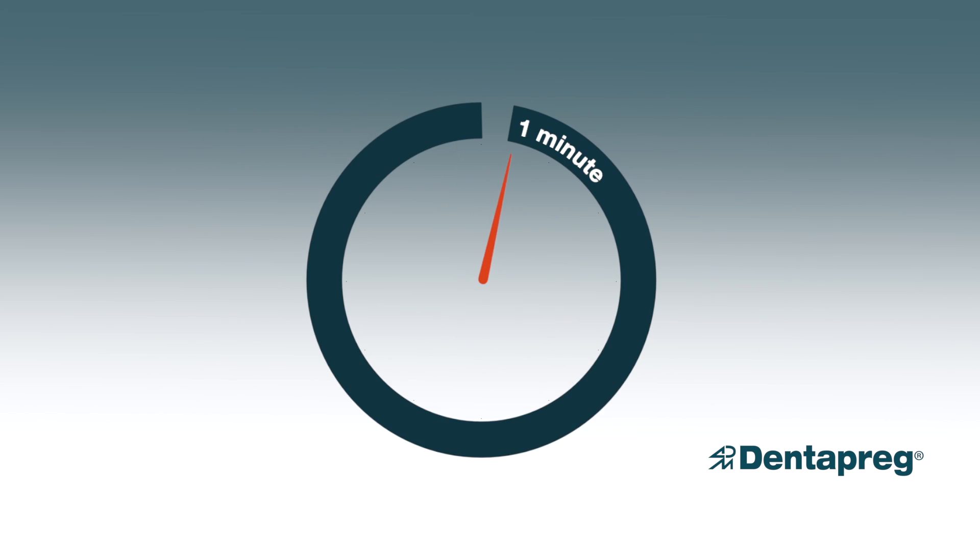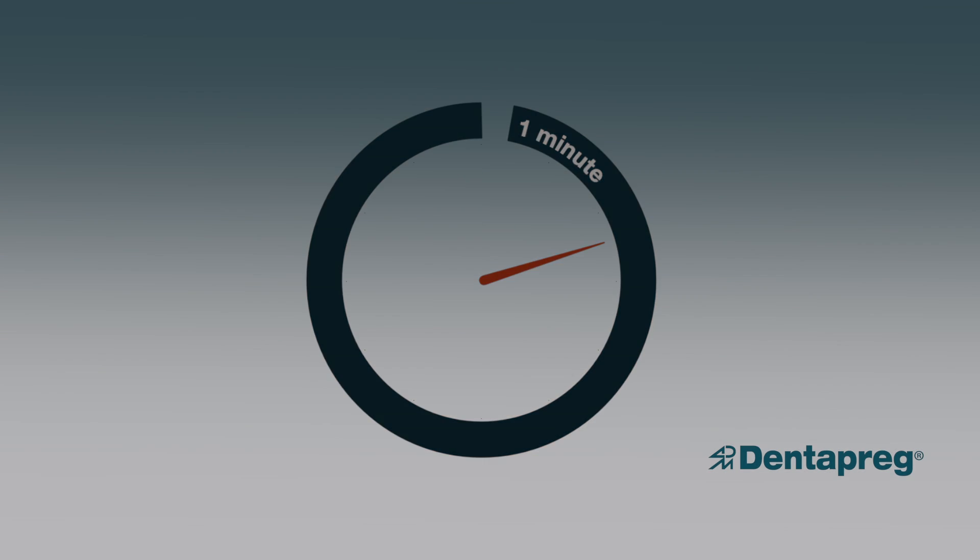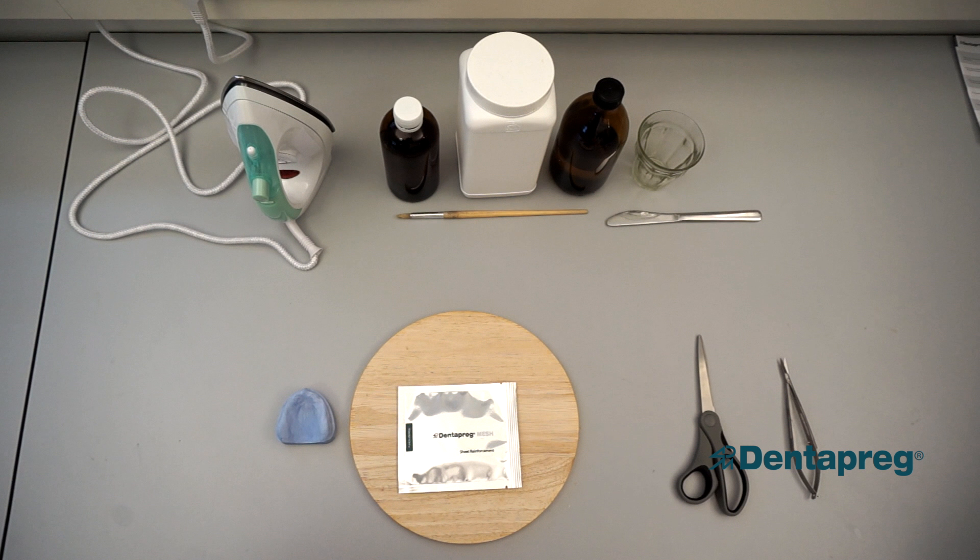Dentepreg Mesh is very easy to use because it can be molded and cut to a desired shape in less than one minute. All you need is a regular iron and a couple other common items.